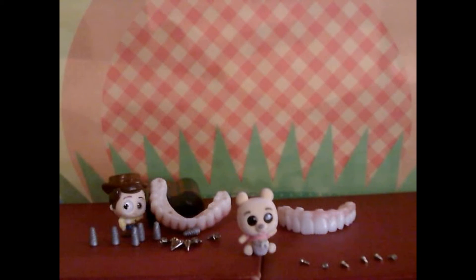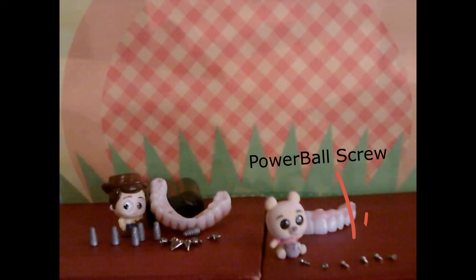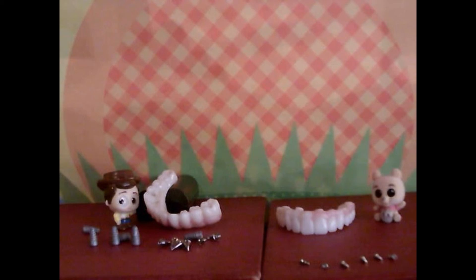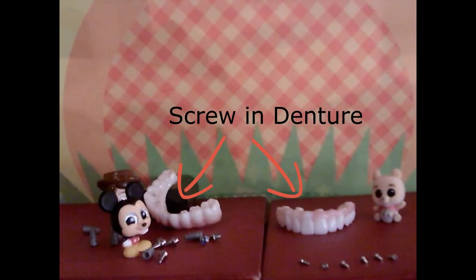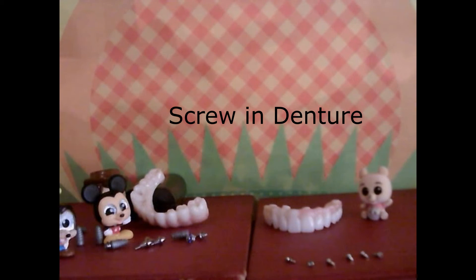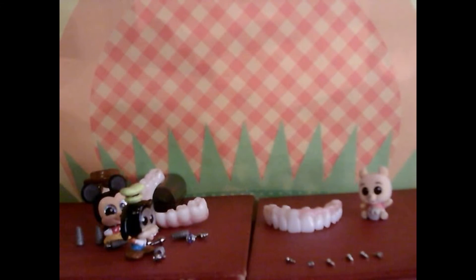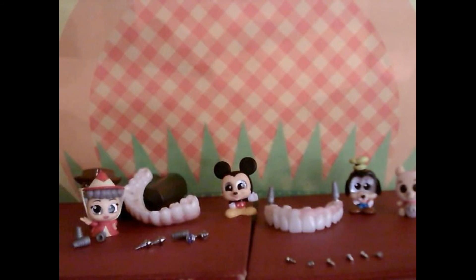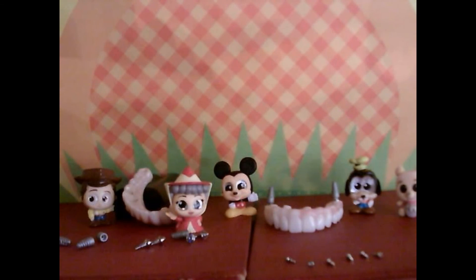Here we have our latest technology, the Powerball screw. And let's not forget the star of our show — the screw denture. Okay, let's put it all together. Of course, this thing is heavy.